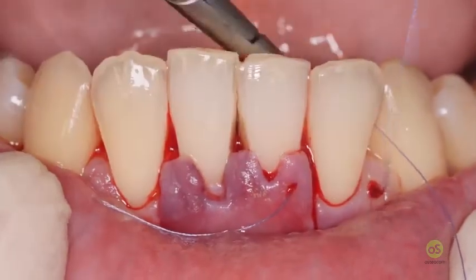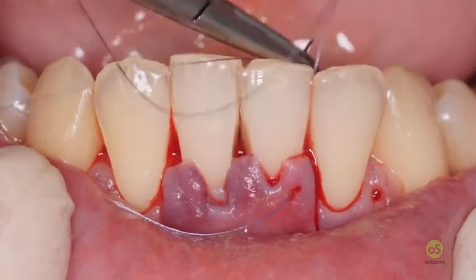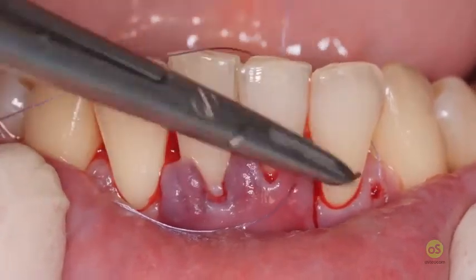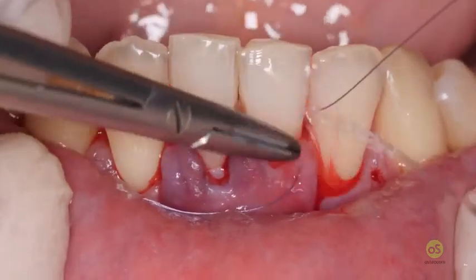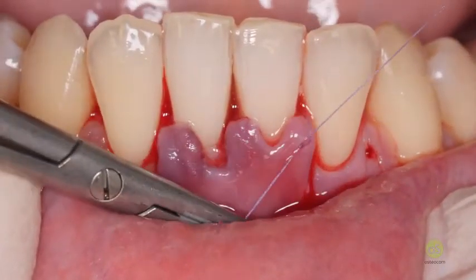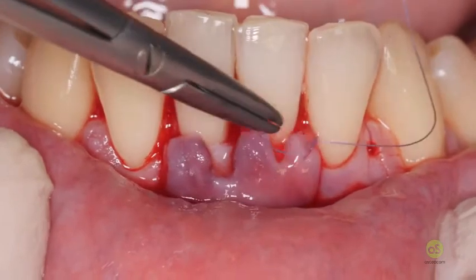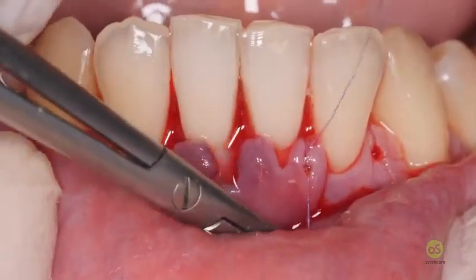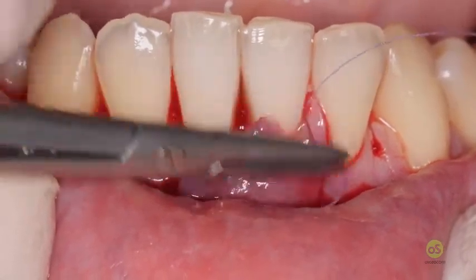So take anchorage to this papilla, going back, and now close the surgical knot, to place the papilla in the final position without pulling it. It's only a positioning suture, so I want to check that this suture is in the middle. I don't like it at all.